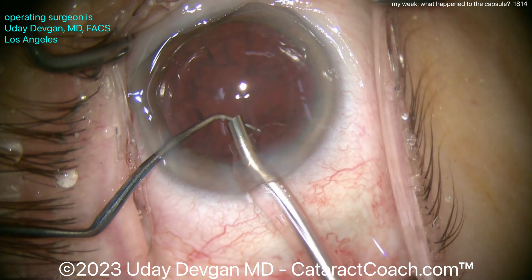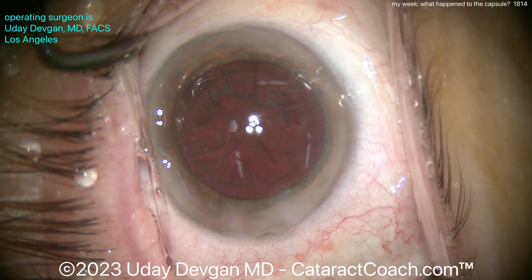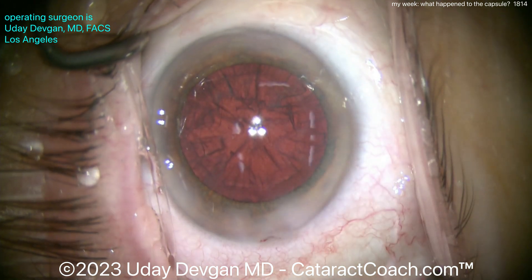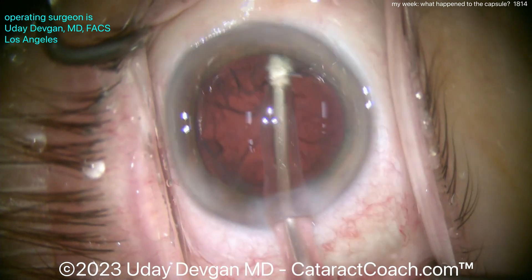Here's the end of nucleus removal. Now let's look at the capsule and cortex removal — watch carefully in this case. I want you to tell me what's going on. Again, a routine case that I performed this week. I'm adjusting the scope lights to get a better red reflex — more of the coaxial lighting instead of the paraxial lighting.